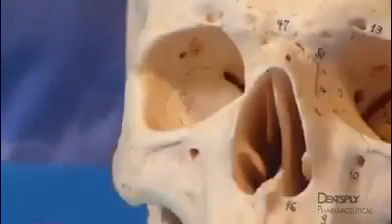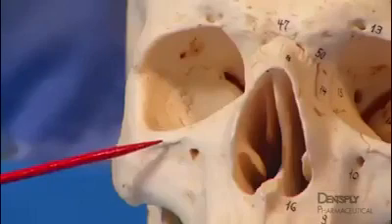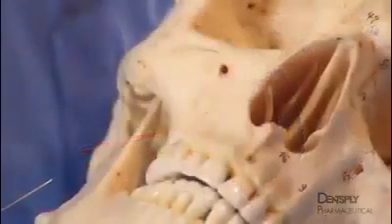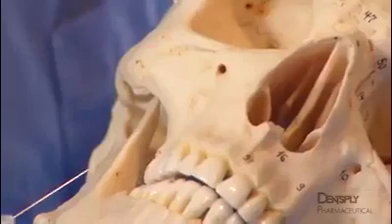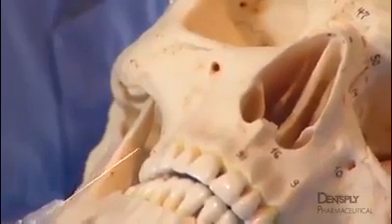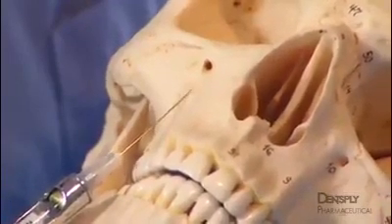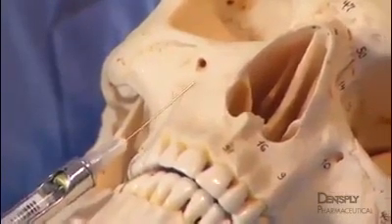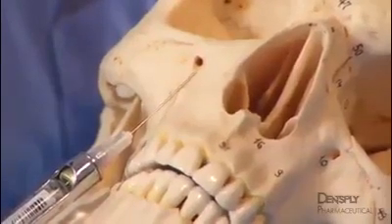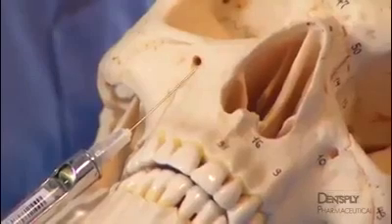An important advantage of this vertical approach is that the overhang of the infraorbital rim protects the eye from accidental needle puncture. Correct orientation of the needle bevel during insertion offers two potential advantages. First, if bone is contacted prematurely, the heel of the needle bevel will tend to glance gently off the bone without scraping the periosteum. Second, the spread of anesthetic into the foramen and canal may be aided.